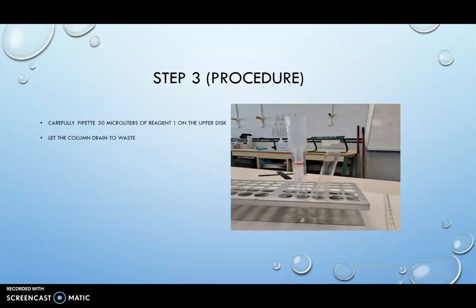Step 3: Carefully pipette 50 microliters of hemolysate on the upper disc. Let the column drain to waste.